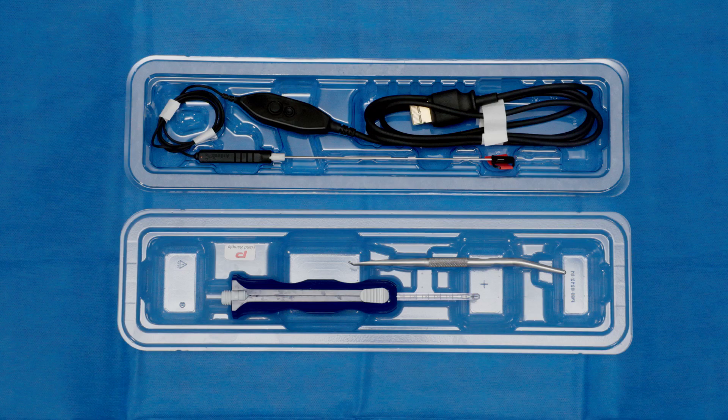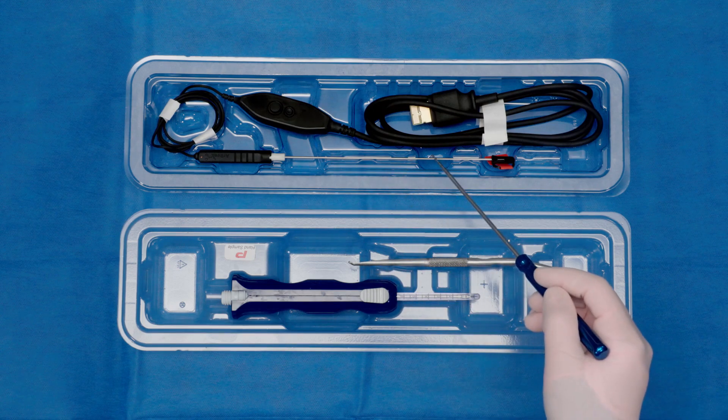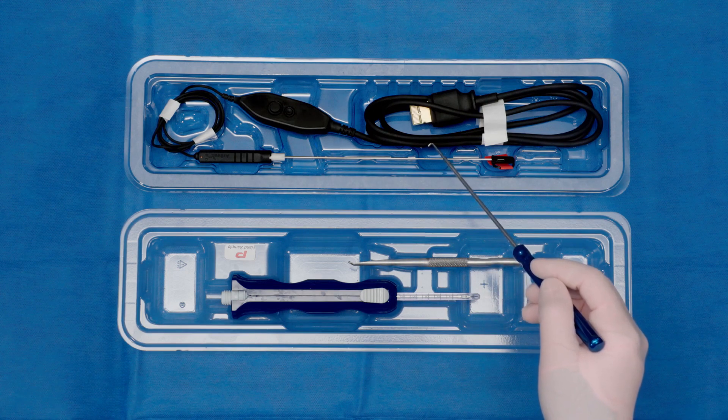This is a fully disposable endoscopic carpal tunnel release kit. In this one set, there are three items: a centerline release handpiece, a dilator as well as the elevator, and the 180-millimeter nanoneedle scope.